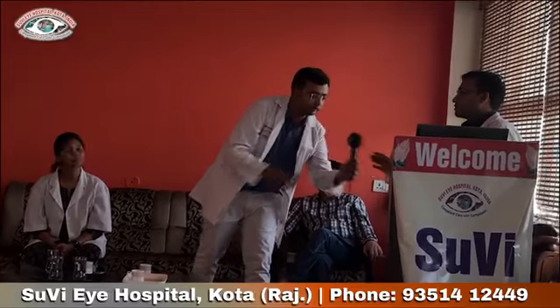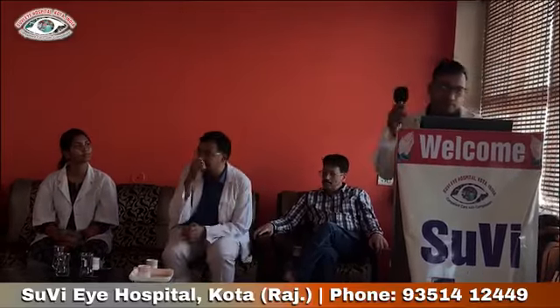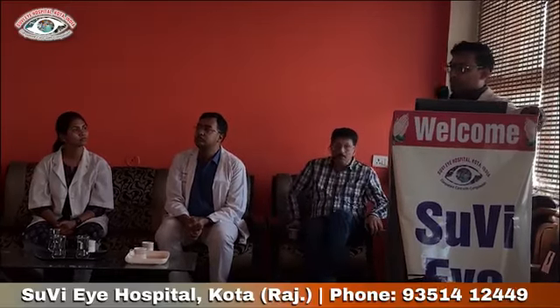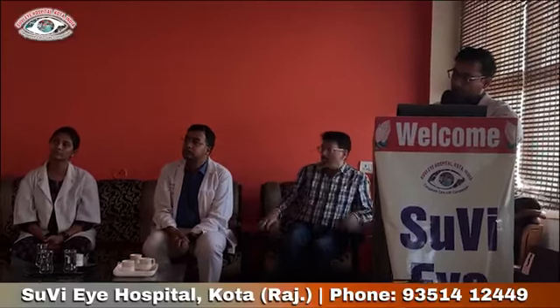Thank you. Now coming to the barrage lasers. Usually we do 2 to 3 rows of confluent burns around the lesions, and it is very important to cover the margin of the lesion.